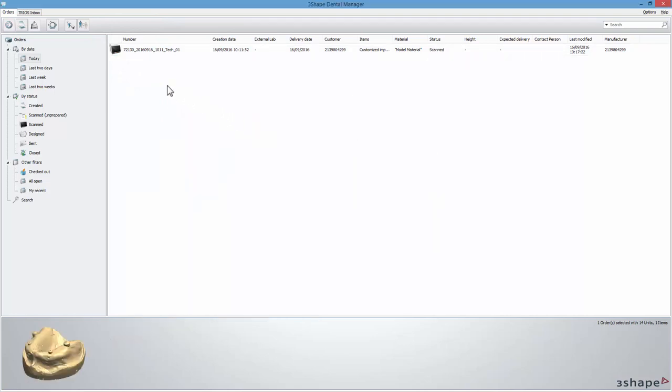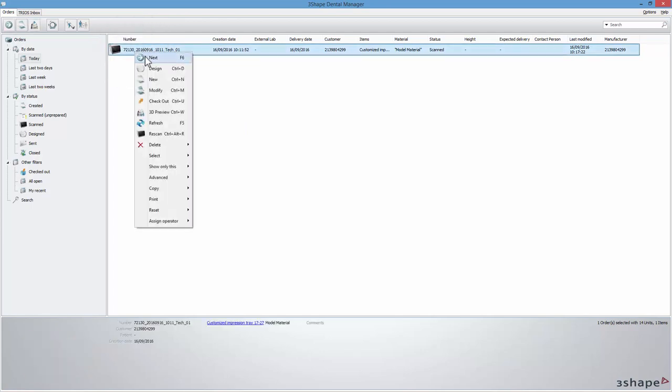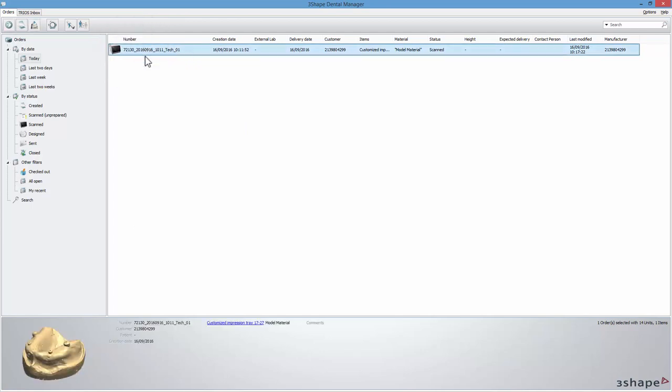After importing we will proceed to the design stage. Click Next to move to the surveying and blocking out step.